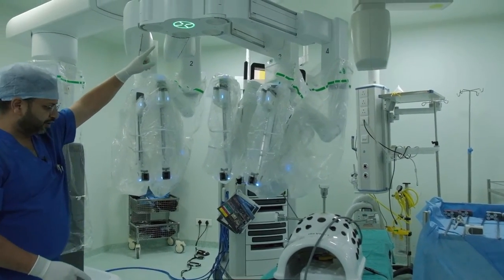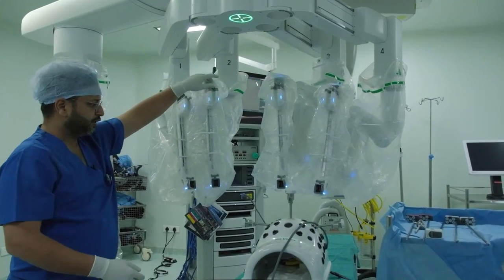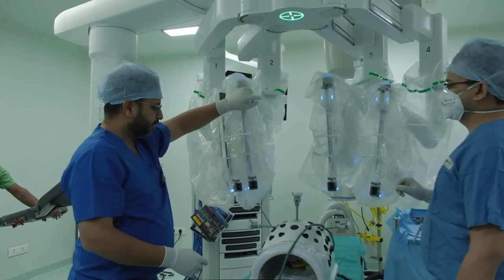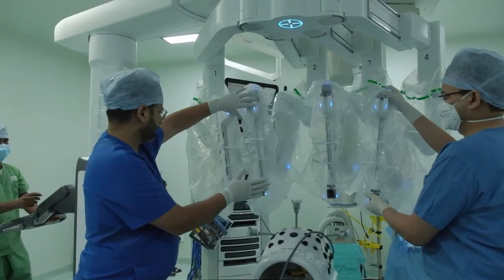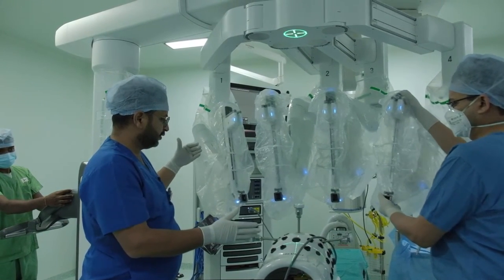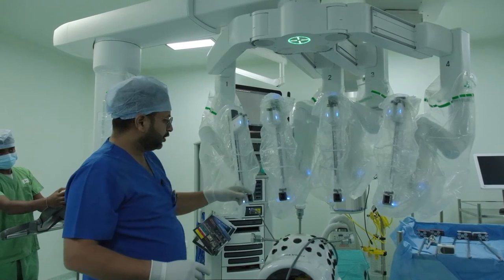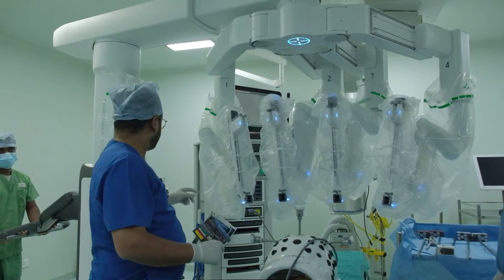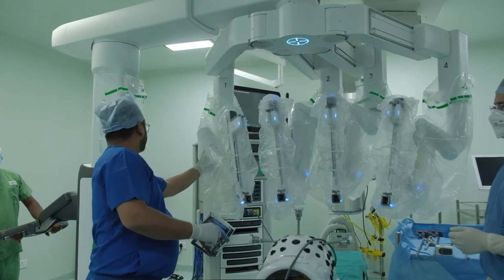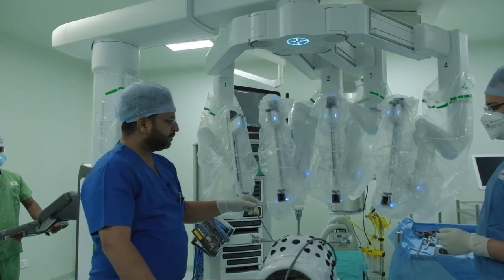So please come forward, come forward, and that's it. Now move slightly upwards towards the patient's leg. Towards the patient's leg. Some more, some more, that's it. So now you can see the laser light is exactly at the endoscope position. Now we can put in the endoscope.